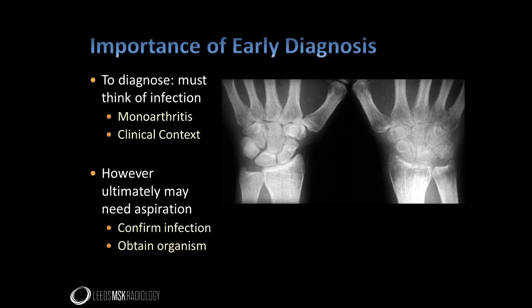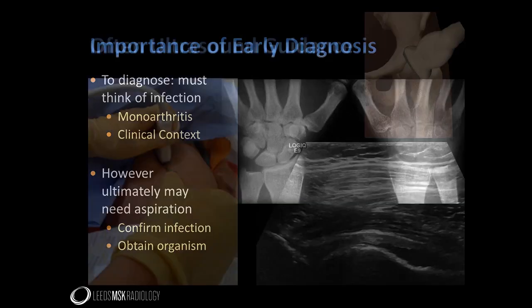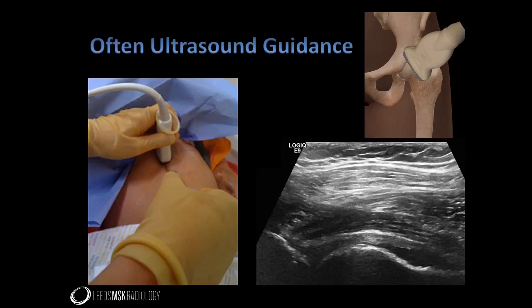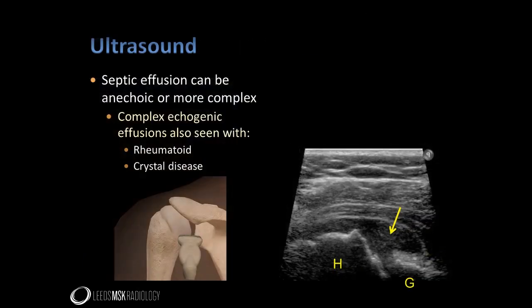Ultimately, aspiration of the suspected joint will often be needed to confirm the diagnosis. Even when the diagnosis is apparent, aspiration will commonly be required to obtain an organism to guide treatment. In my practice, ultrasound is most frequently used to guide aspiration, as in this case of hip sepsis. On this longitudinal ultrasound of an infected hip, we can appreciate the acetabulum, femoral head, and the effusion to be aspirated. It is important to realise that the ultrasound appearances of a joint effusion cannot be relied on to distinguish joint infection from a sterile effusion. An infected joint effusion can have a complex echogenic appearance, as seen here showing the posterior aspect of the glenohumeral joint.